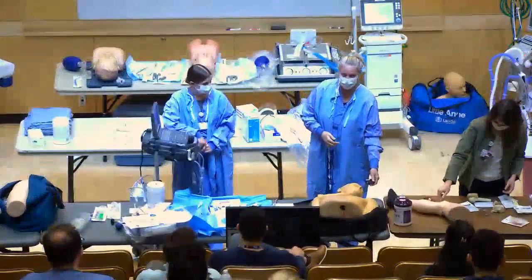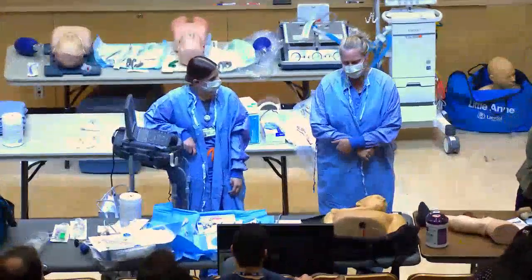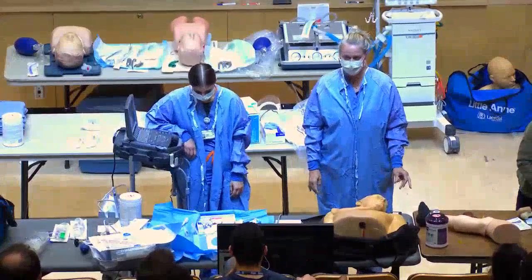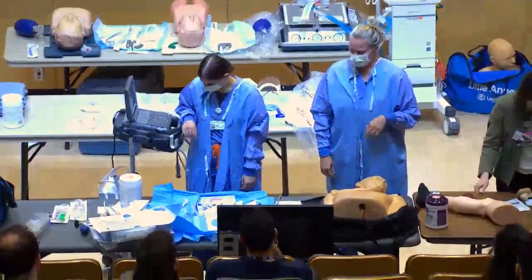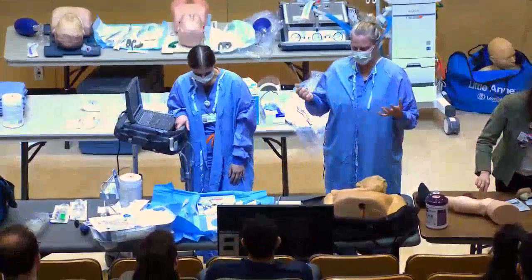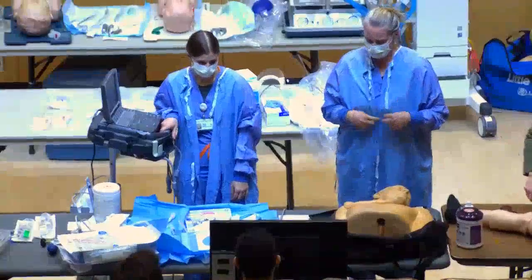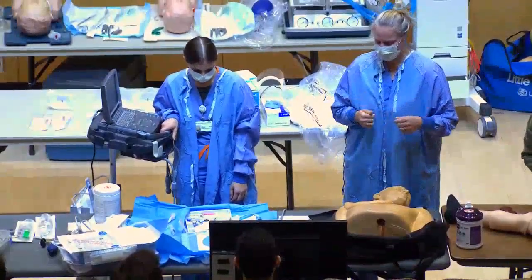Hello, I'm Kristen, a Surgical ICU PA working with Dr. Stilatos, and this is Lindsay, another SICU PA. We're going to demonstrate a central line. This is a sterile procedure — you need a head cap, face mask, sterile gloves, and sterile gown. You can pretend I have all that on right now.